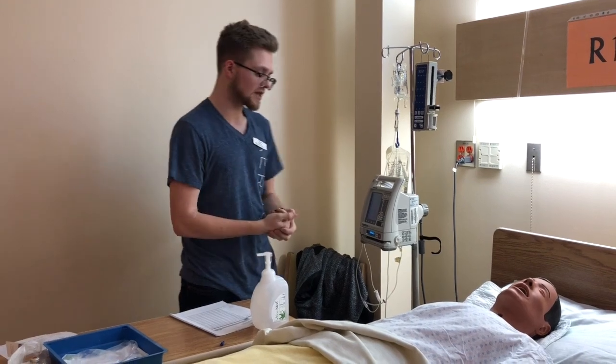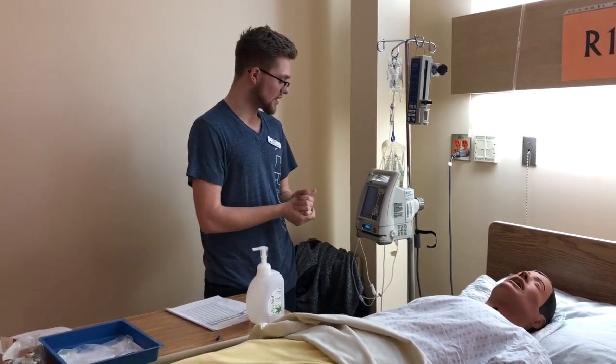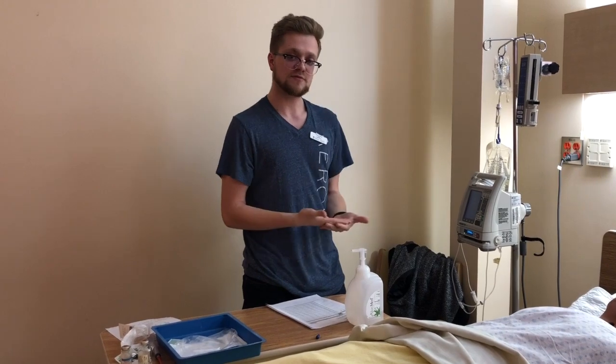We'll say, okay, so now the medication is infusing. I'm gonna come back in about 10 minutes and just make sure everything's running smoothly, and then in an hour it should be done, and I'll come back and check up on you. And at that time you wanna do the right evaluation, check on how their symptoms are doing, if they've improved at all, if anything's going wrong.